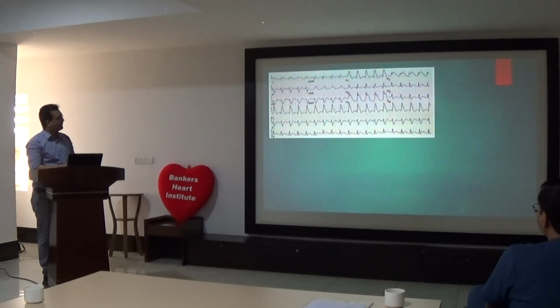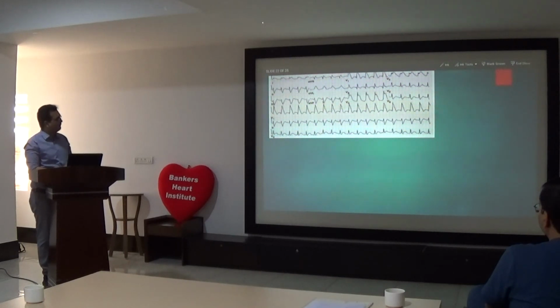In this ECG again, there is significant ST elevation in leads V1, V2, V3, V4, that is the anteroseptal leads, as well as leads 1 and aVL. And significant ST depression in the inferior leads. So this is a lesion producing high lateral MI as well in the case of anterior wall MI. So this is a lesion which is above S1.